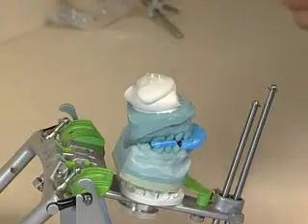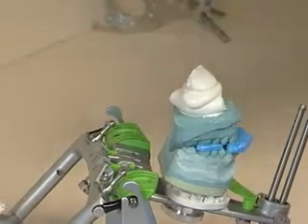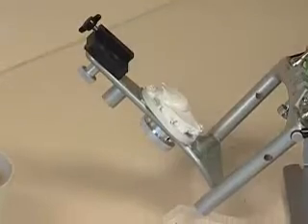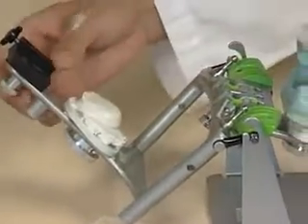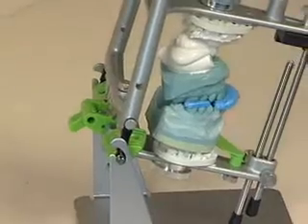Add some to your lower. Add it to your lower, the mounting plate. Okay, that's good. You're gonna have to catch some of it now. When you close it, it's gonna come forward on you. Okay, perfect. You did good.